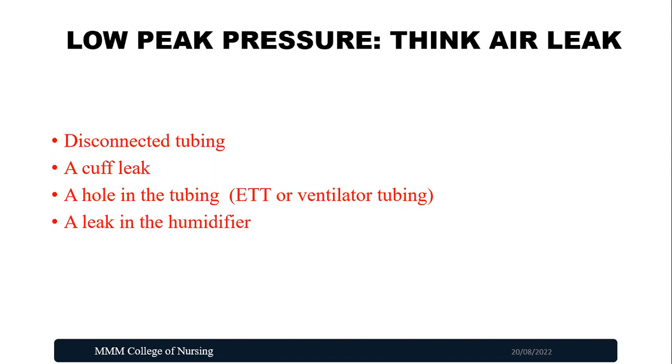But we also have to think about two more reasons for the low peak pressure. One is the chest tube leak. Suppose the patient is having chest tube drainage, there could be holes in the distal chest tube. Then check that there are no leaks in the tubing or connections. Consider repeating a chest X-ray and advance the chest tube as required.